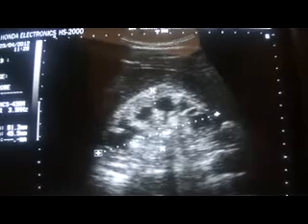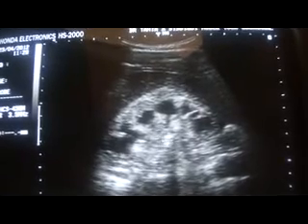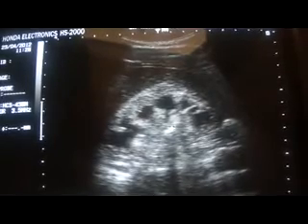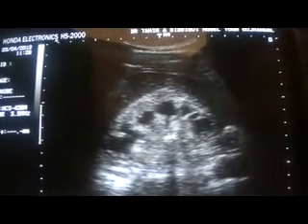And the fourth point is to note the degree of prominence of these pyramids. You hardly see pyramids dilated to this extent. This is the medulla, and this is the medullary pyramid. So the cortico-medullary distinction is intact, though the cortical echogenicity is raised.